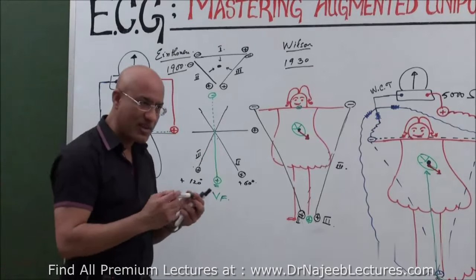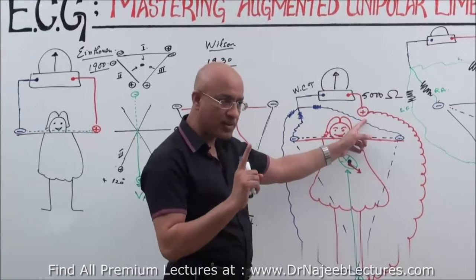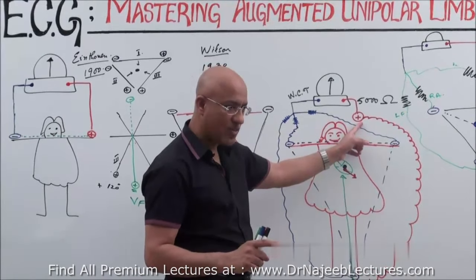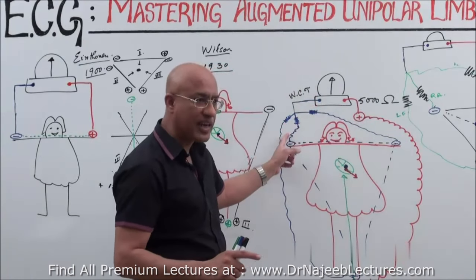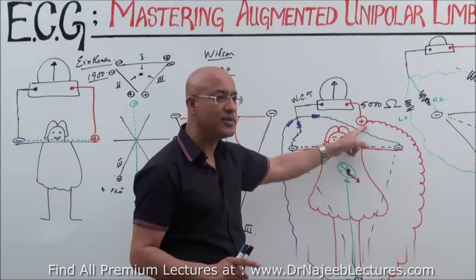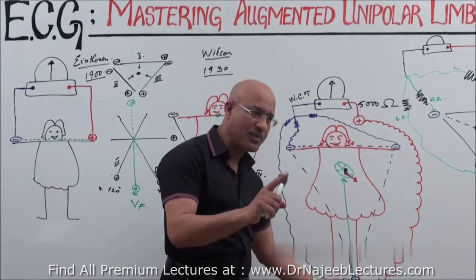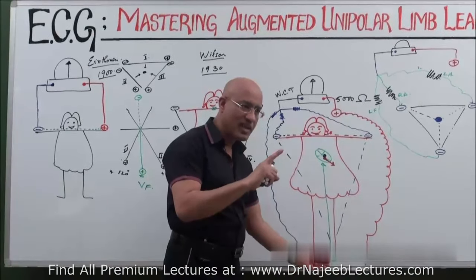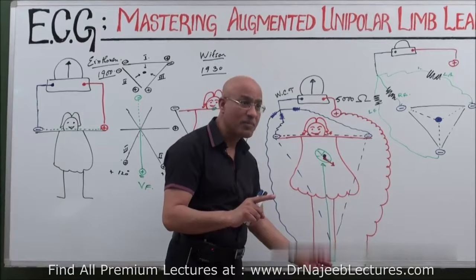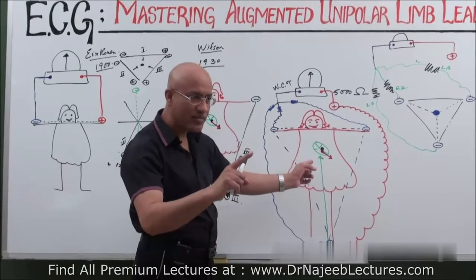Now listen carefully. Whenever a positive electrode is exploring the voltage relative to the indifferent electrode in the body, this lead will be called a V lead. This V is for voltage and F is for foot. V not for other V and F not for other word. This is VF, voltage from the foot, straight at the bottom of the heart. Is that right? Any question up to this?